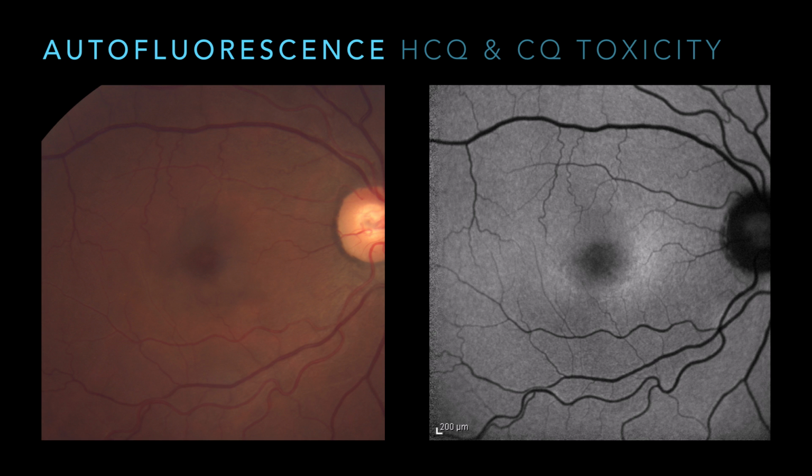For that reason, spectral domain OCT trumps autofluorescence, and I haven't had any cases where I had autofluorescent findings without spectral domain OCT findings. Again, my N is not very big. Multifocal ERG for me is usually like a tiebreaker. There's a question, but it's not my go-to. I don't know if that's been your experience as well.